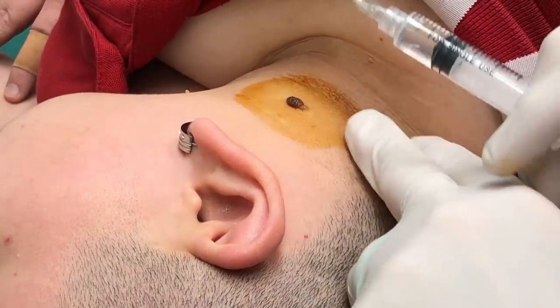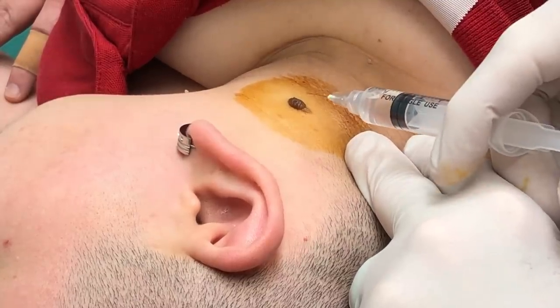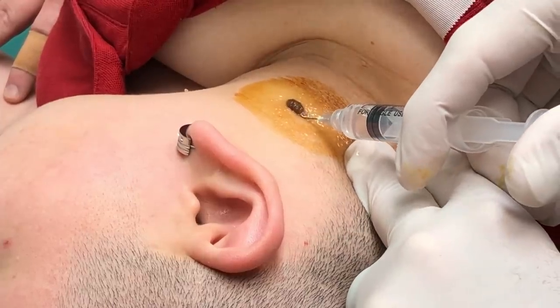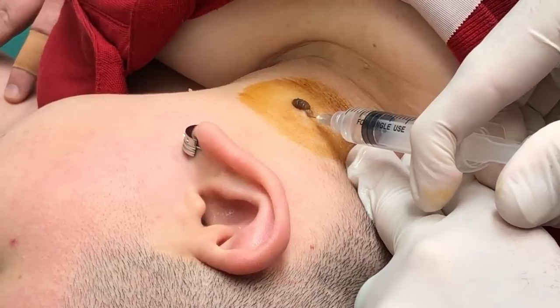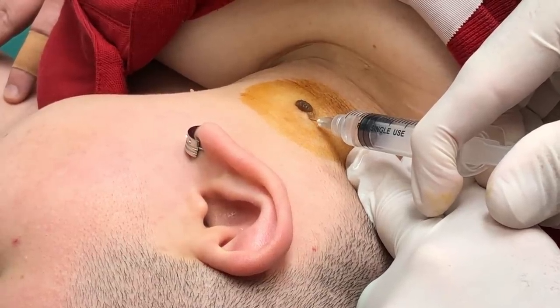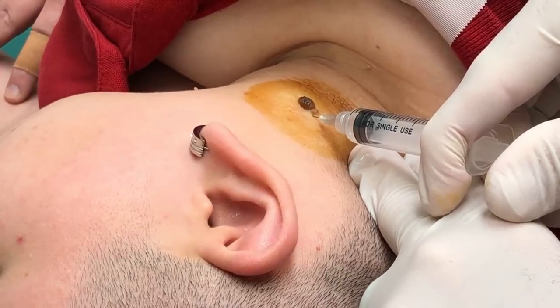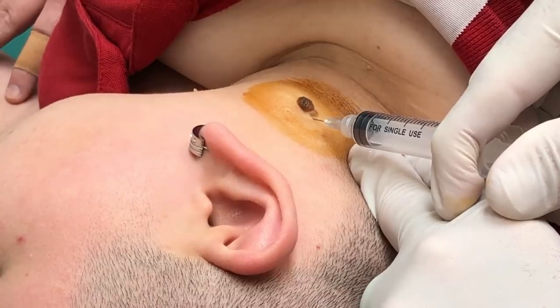We're going to go ahead and spray a little cold spray, then you're going to feel a little stick, sting, and a burn. Here it comes right now. Are you ready? Yes. Cold spray and then here it is, it's going to burn. I think I just froze the needle. No, you just got my finger pretty good though. That's okay. No hurry. Is it burning? Yeah. It should burn a little bit. If it doesn't burn, it means it's not working. So you kind of want a little burn.